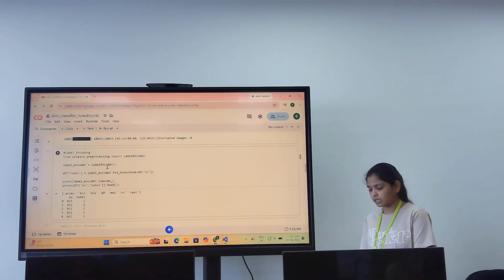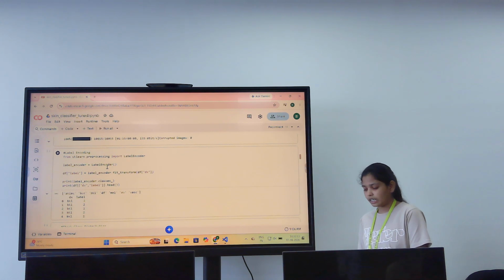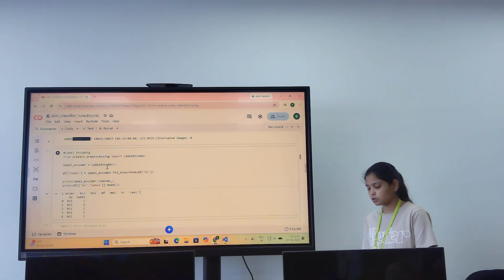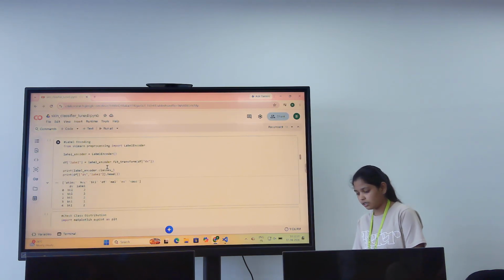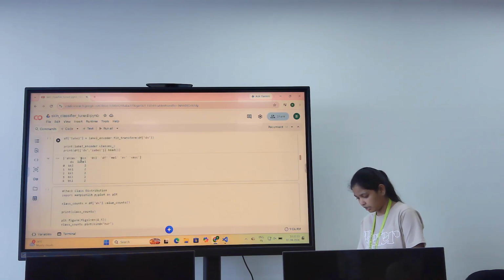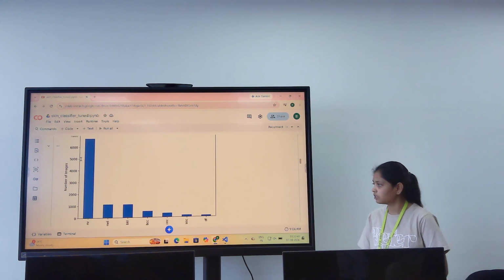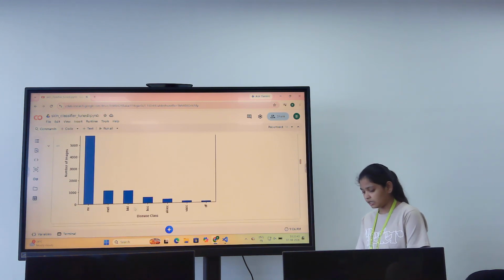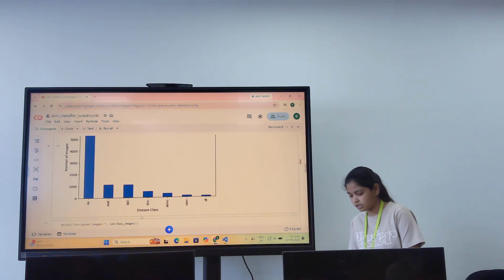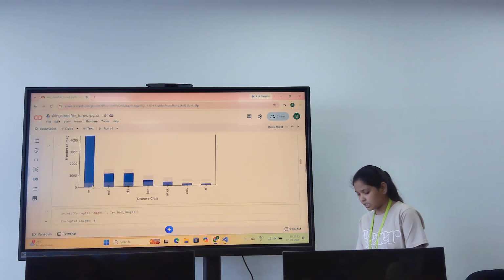In the dataset, the diseases are categorical values. The model works on numerical values, so we convert them to numerical ones. So I use label encoding. Here I have done my label encoding. From this graph we can see the x-axis is the disease classes, and the number of images which belong to each disease class.